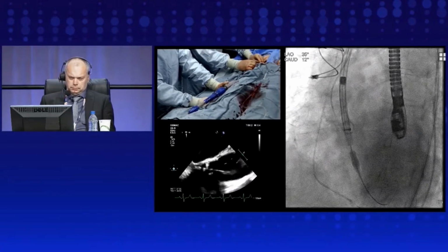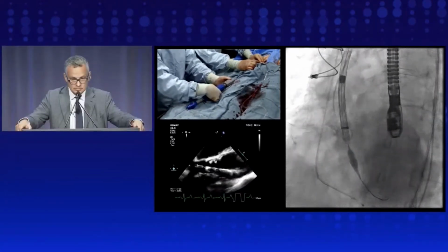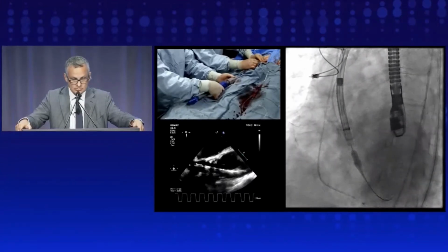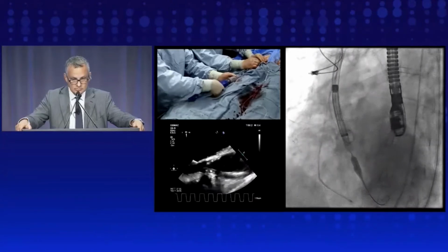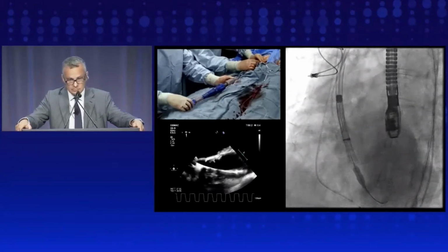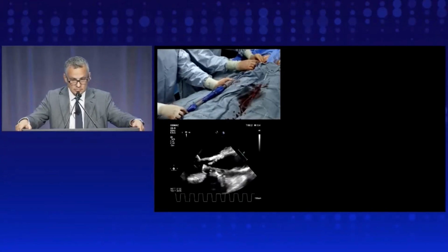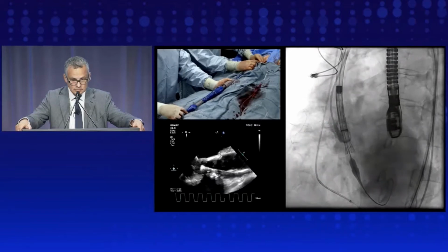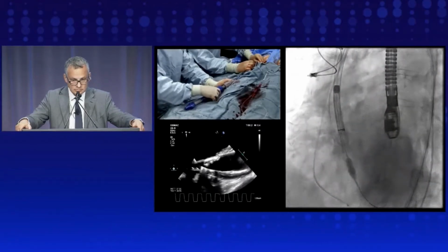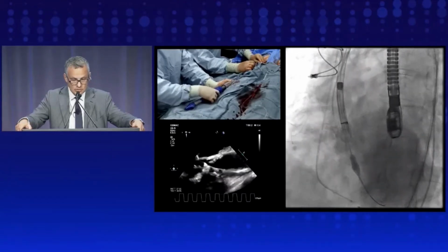Pacing at 120. You can do deeper. It's going to be deeper than that. So one of the problems we thought we'd have with the AI as it's delivering is that we wouldn't get a picture to be stable, but at least now it's stable. We're in a little deep there. Probably just caught off the edge of the cusp. Let's take a picture. Inject. Okay, maybe a bit higher. Yeah, so we're a little low. Yeah, I'll go slow. That's good. Yeah, letting it flower.